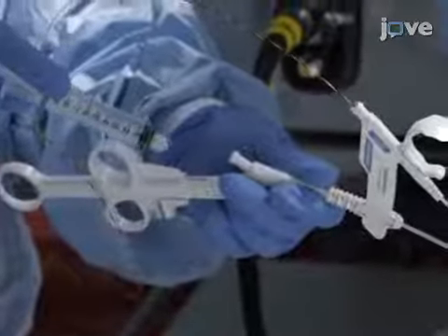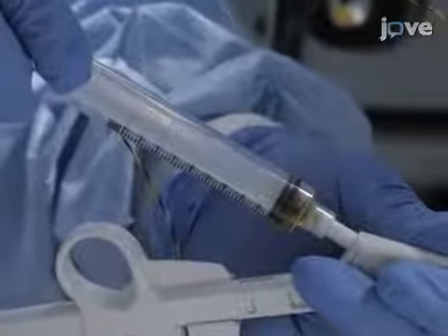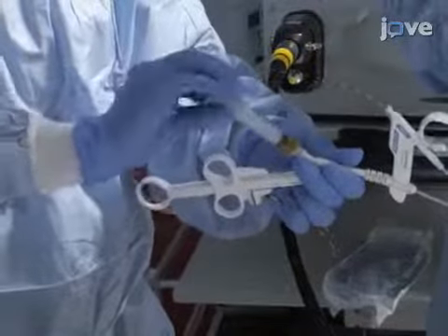After removing the guide wire, attach a 10 mL syringe to the guide wire port through the luer lock and use 10 mL of negative pressure to aspirate the bile. Remove the syringe containing the bile.